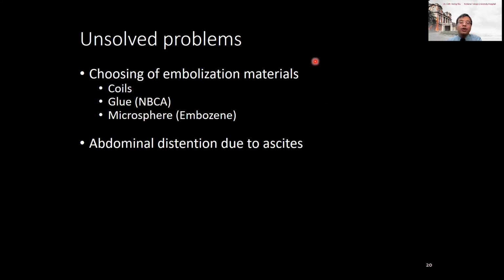Okay, so we think that renal artery embolization can improve the symptoms and signs of polycystic kidney disease. However, during our intervention, we have met some unsolved problems.